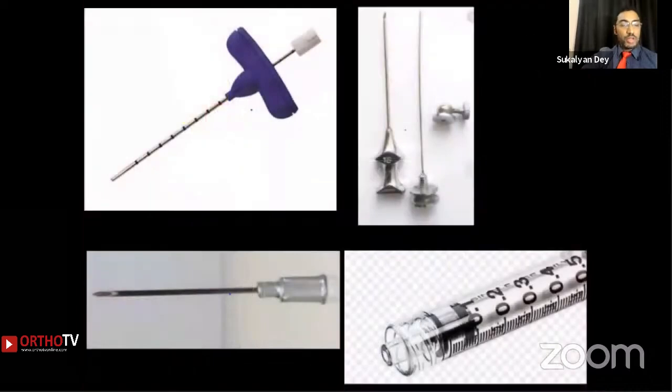Now, we are going to replace each cubic centimeter of the cyst space with 1 cc of 3% polidocanol. Maximum allowable volume is 10 ml, but there is a technique to get around this in cases of larger cyst, and that will be discussed later on.